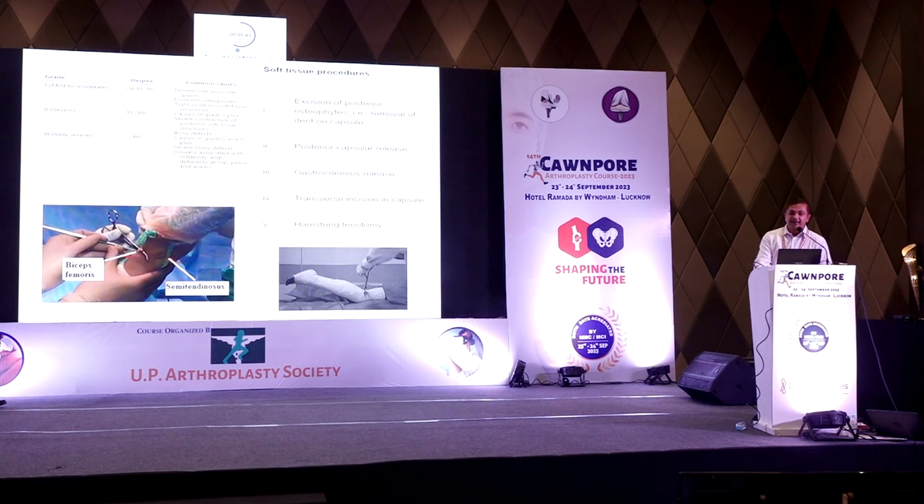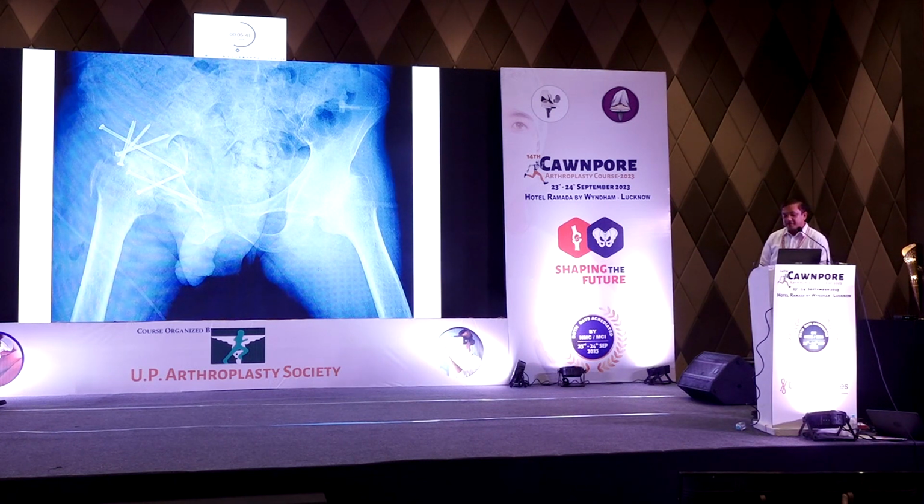Another surgeon tried to do it. So then it became more complex. What did the previous surgeon try to do? Sir, someone tried to do a total hip, but while doing the hip, they cut everything. Now we have this. So there is almost no acetabulum, nothing, and so complications and then more complications.